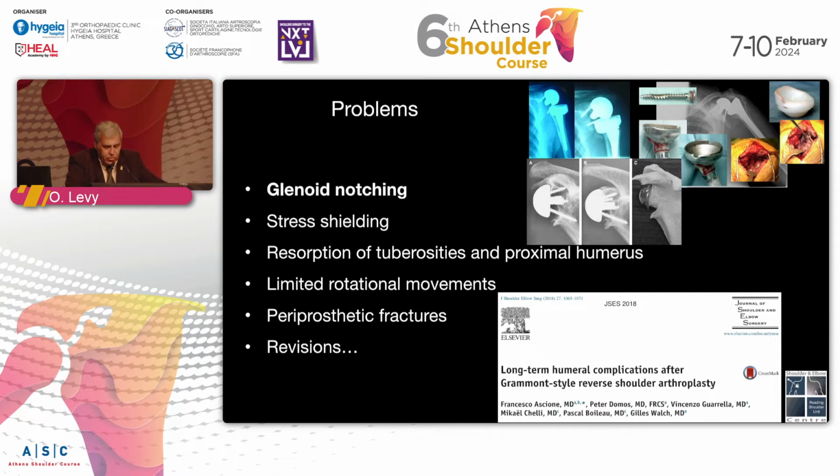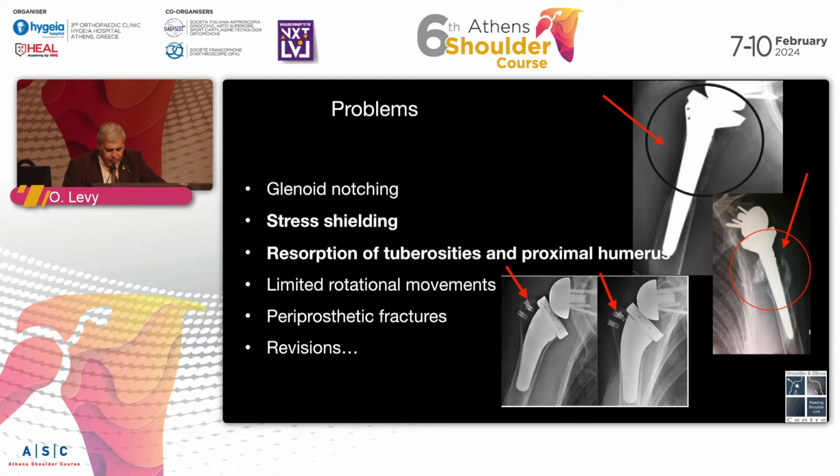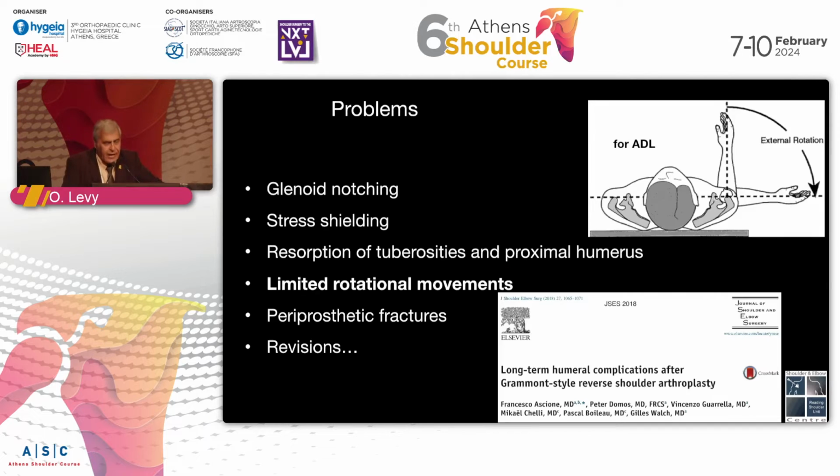There's glenoid notching, we know that. There's a problem with stress shielding, and not only with the long stems, with the short stems as well. And we see disappearance of the greater tuberosity and the proximal humerus. There are limited rotational movements, and we just heard in the last session how to improve both external rotation and internal rotation. And we know from this study from the Gilles Walch group that in the long term, the majority of the problems with reverse shoulder are with the humeral stem rather than the glenoid.